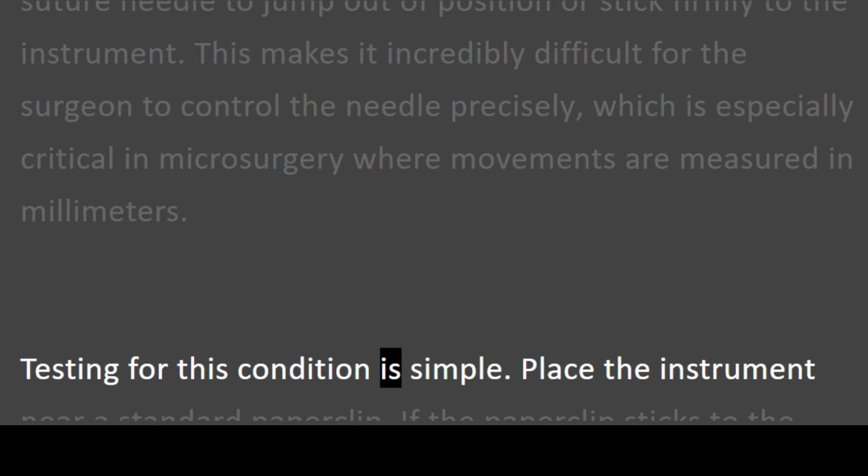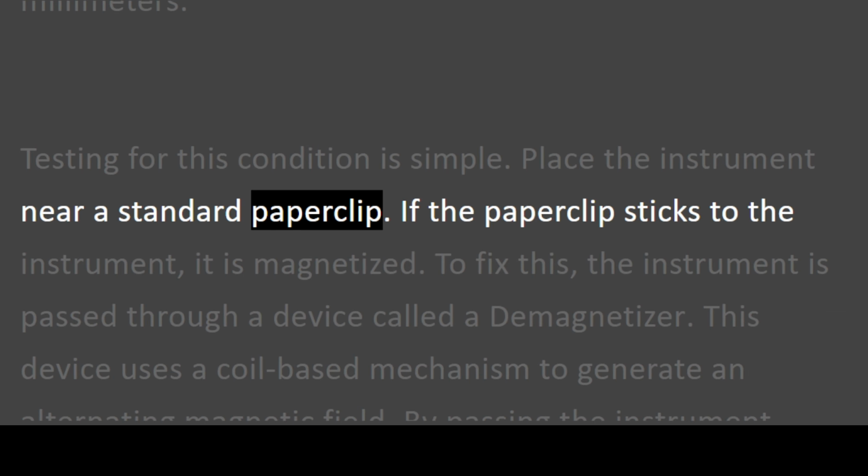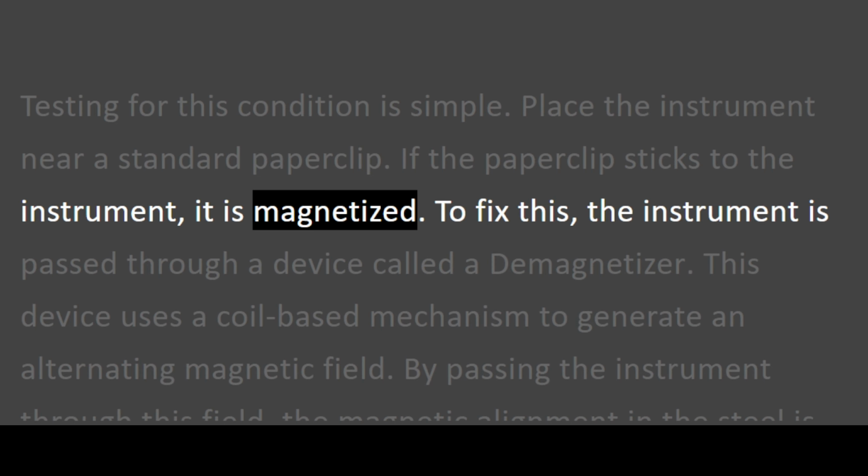Testing for this condition is simple. Place the instrument near a standard paperclip. If the paperclip sticks to the instrument, it is magnetized.